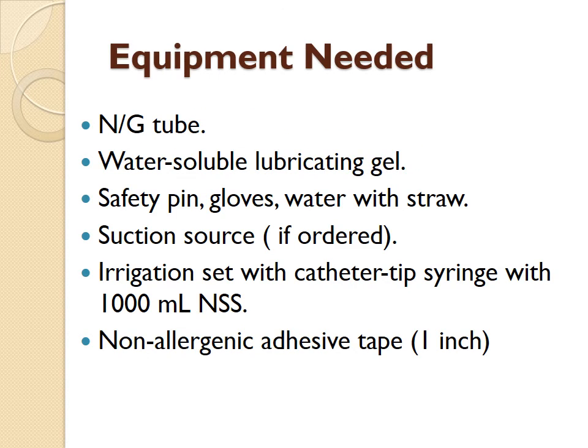So now let's talk about the equipment that's needed, the actual nursing procedure. In most facilities, only the RN is allowed to insert a nasogastric tube. However, there are some departments in specific facilities where the licensed practical nurse, the LPN, can place the tube.